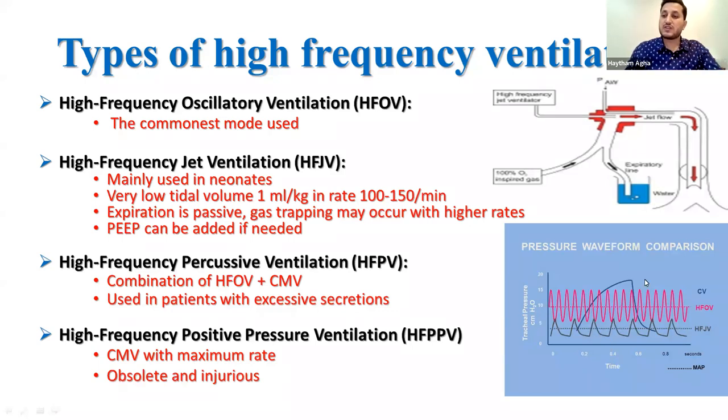If you want to recruit the lung, we can connect the high frequency jet ventilation to conventional mechanical ventilation or even CPAP just to give PEEP for the patient. This requires more sedation and sometimes paralysis.